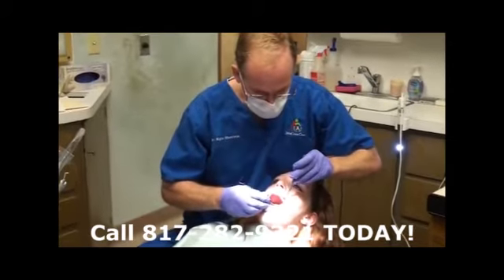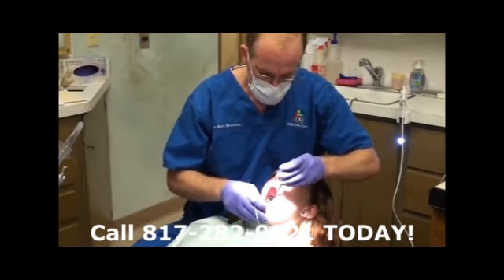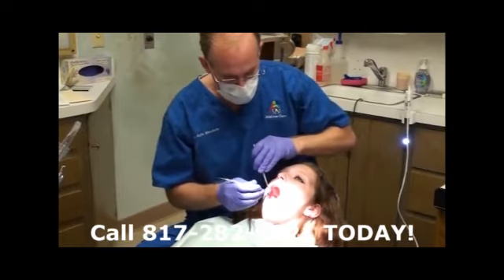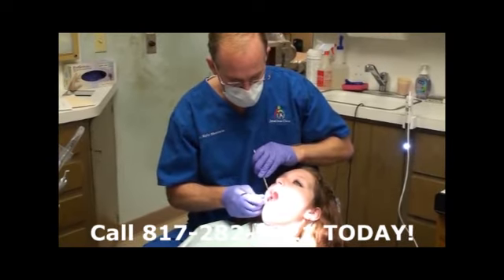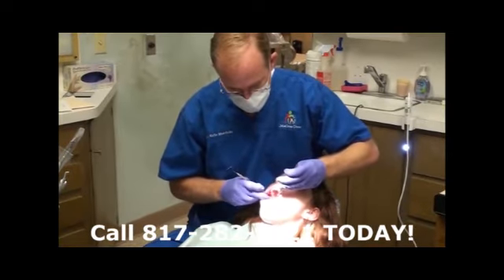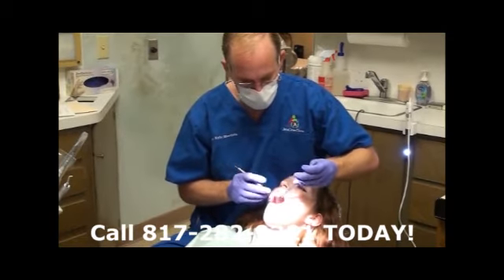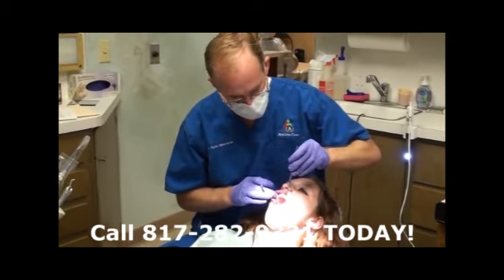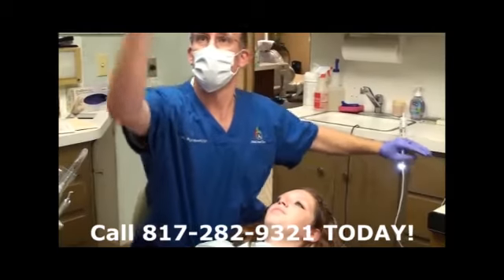Generally speaking, she has beautiful teeth. She takes pretty good care of them. It's evident that she needs a cleaning, but nothing for her to worry about, except for some routine preventative care. Okay, let's take a look at these images.